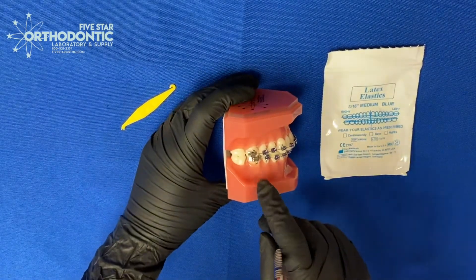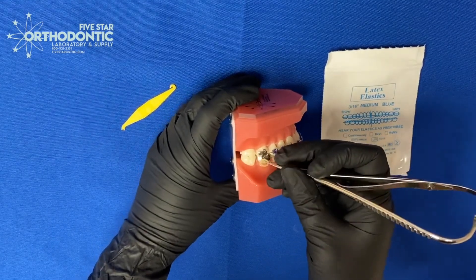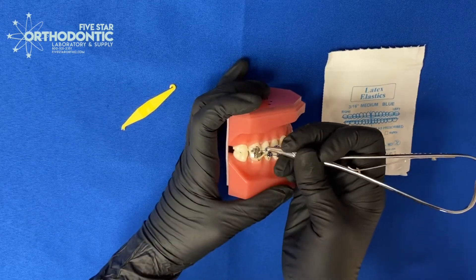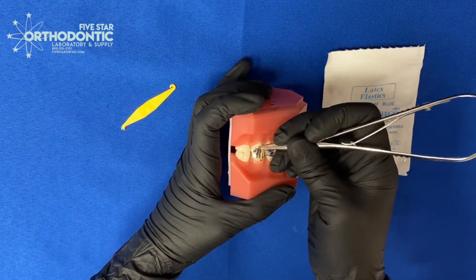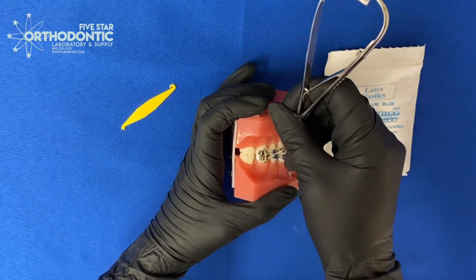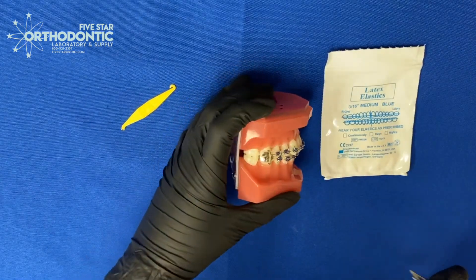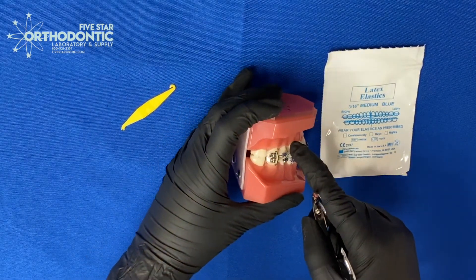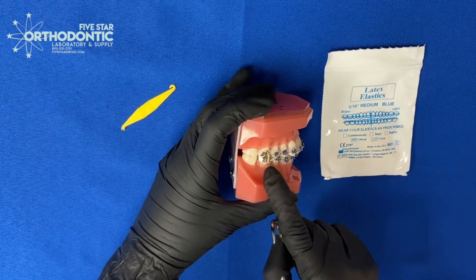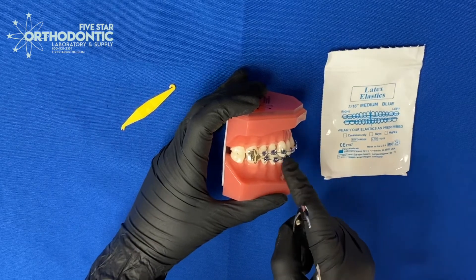Say for instance we were trying to bring up this lower six — we would attach our elastic to the lower six and connect it to the upper five and upper six. That way we've got two teeth on the top exerting force on this single tooth on the lower arch. And remember, we're going to want to go with a heavier arch wire on the top and use something lighter on the bottom.